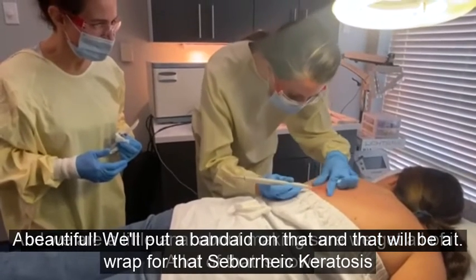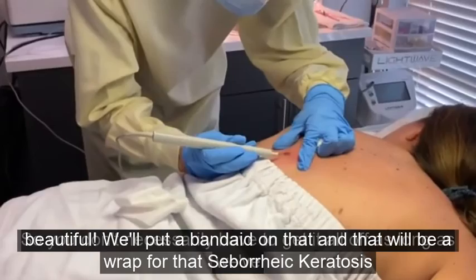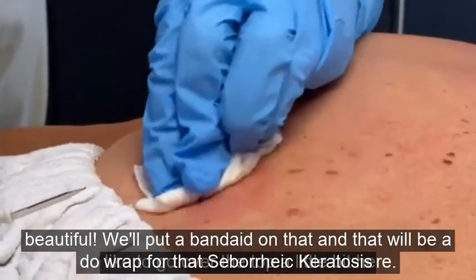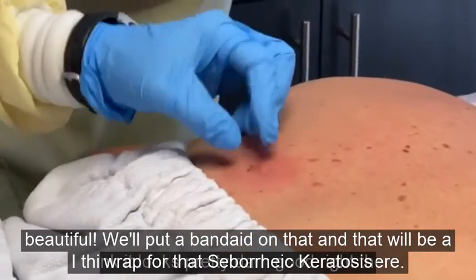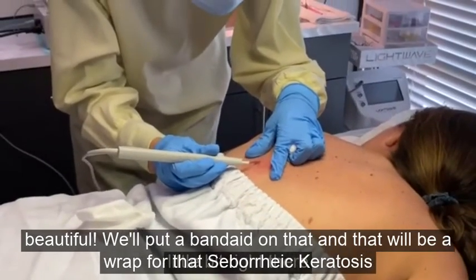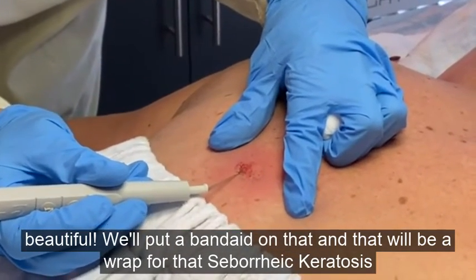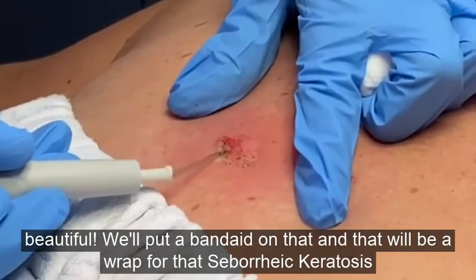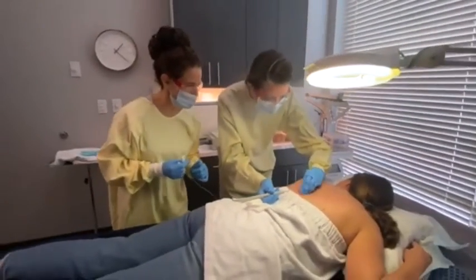We are a little particular about making sure we get all of it. A lot of that remaining material is just dead skin, so you don't necessarily have to remove every bit as long as we've burned it — but we like to be thorough. Let's see what this looks like. I'll just go over that last little bit at the bottom to make sure. There we go — those will flake off now. Beautiful! We'll put a band-aid on that, and that'll be a wrap for that seborrheic keratosis.